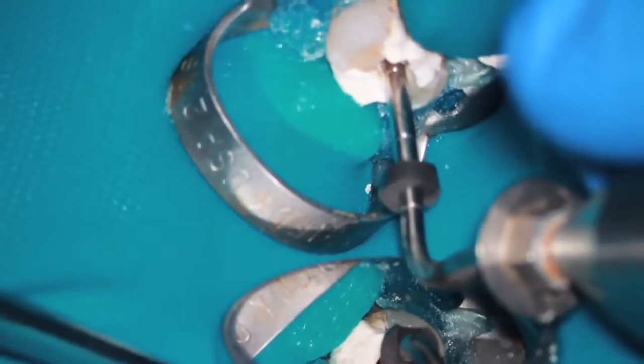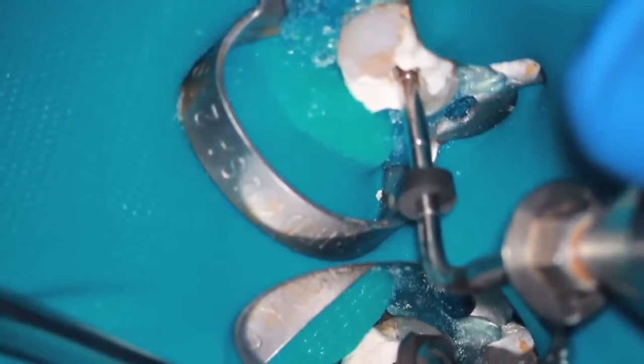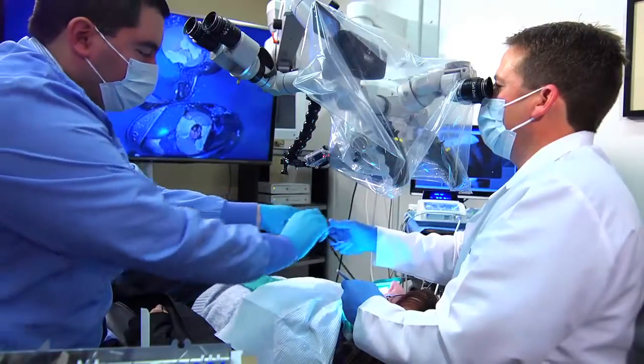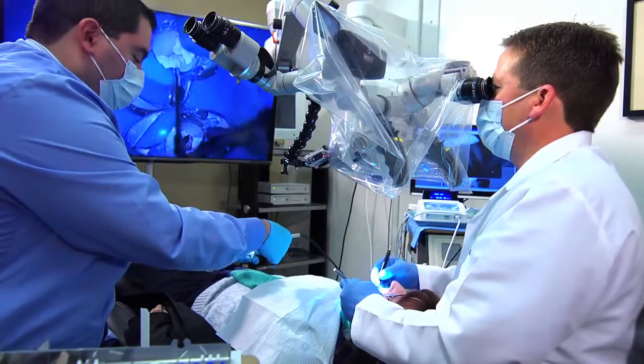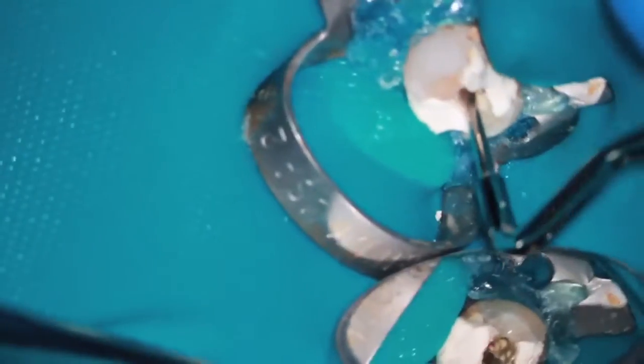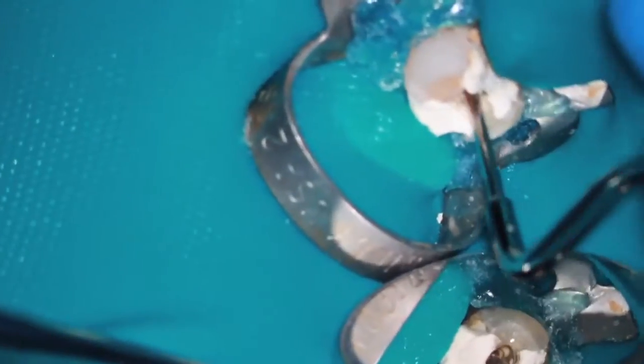I'm going to let off my tip, hold, and I just want to get this now to penetrate some heat in there, touch the wall, and out. Great. And now I'm going to take that moistened segment that I took, and I'm going to compress that down on top of the other one, and that's going to help me get even greater hydraulics on these masses, these segments that I'm slowly heating up and moving laterally and apically.